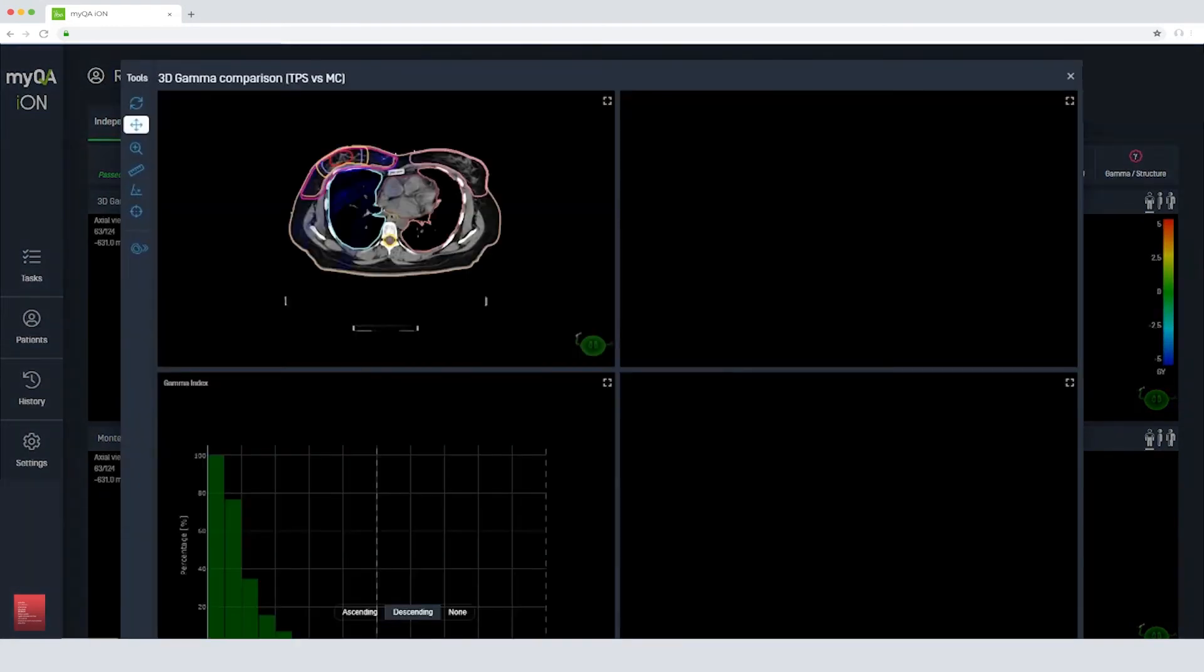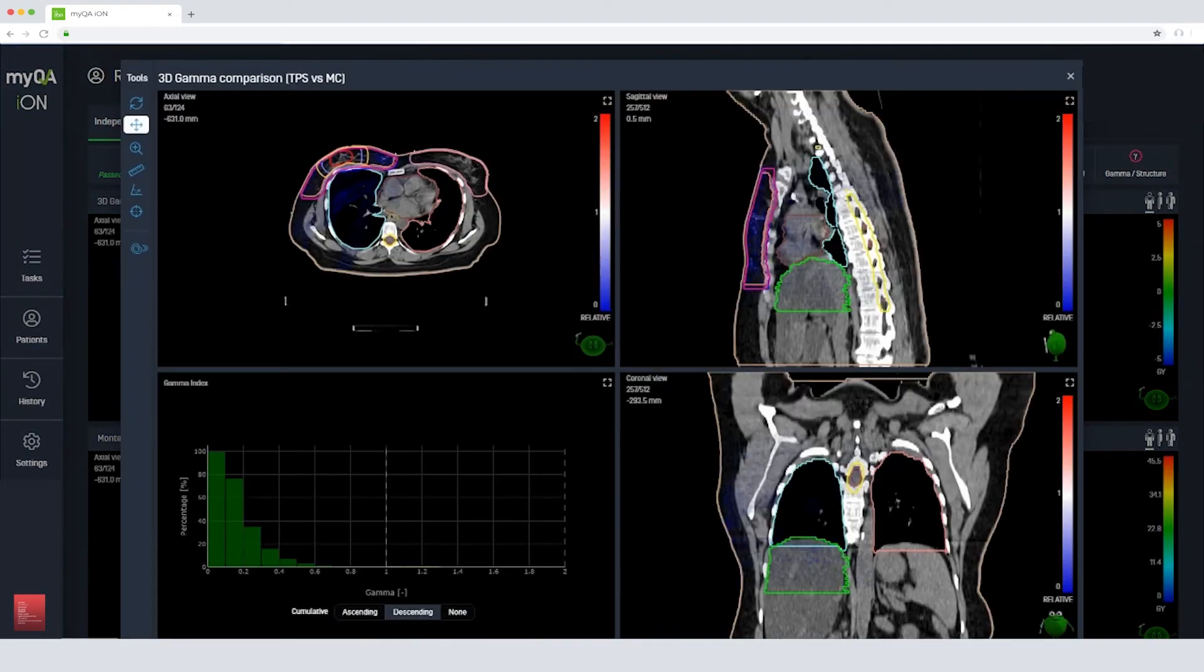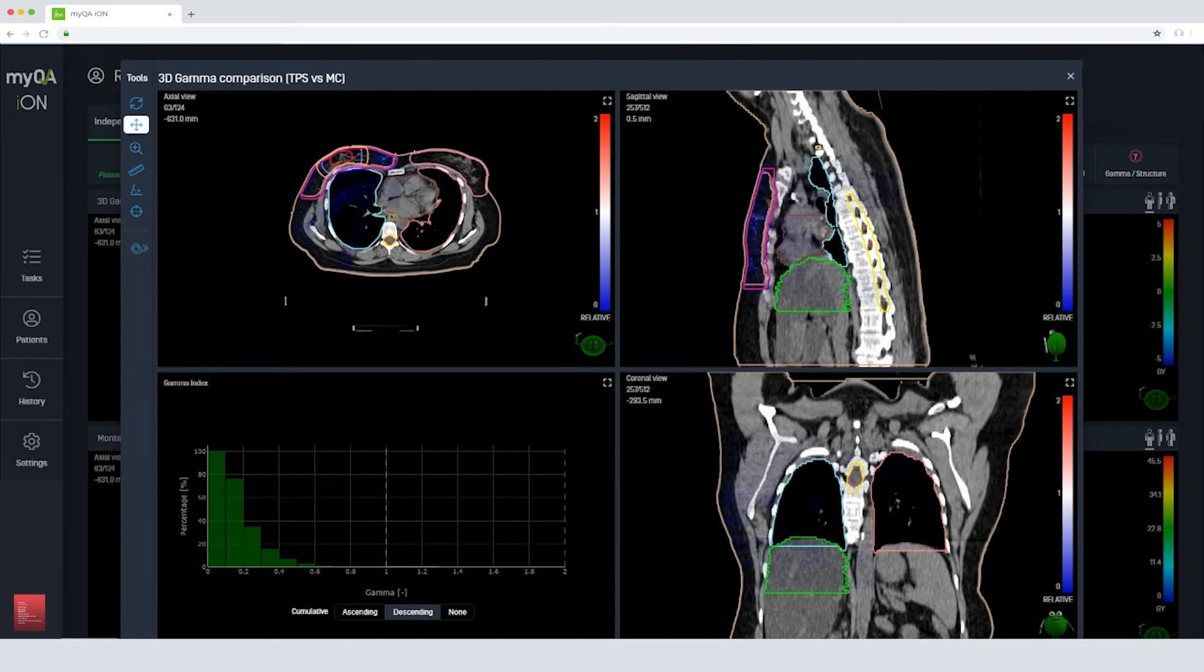As we review the plan, we can see the gamma index values for each structure as well as the PTV. MyQA ION gives you all the information you need to quickly and easily approve or reject the treatment plan.